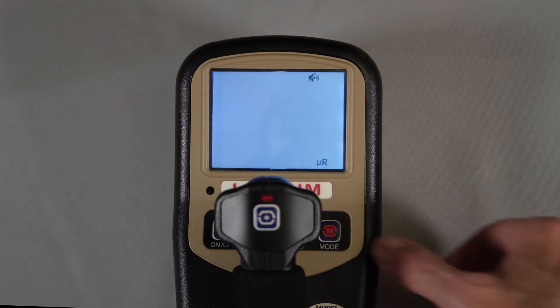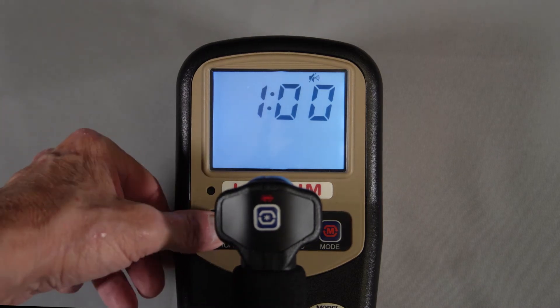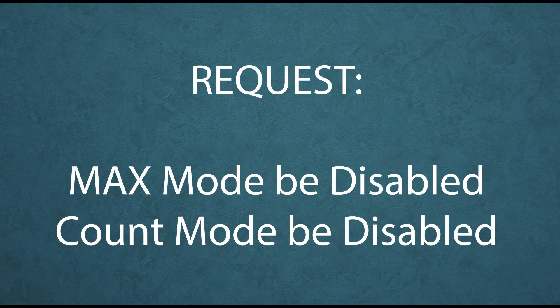Count mode allows the user to perform a count for a predetermined time. Most users are only interested in rate mode, so the other modes can be locked out to make the training and use of the meter as simple as possible. Just request the meter be set up this way when it is purchased or calibrated.